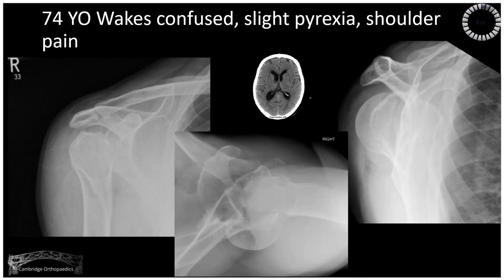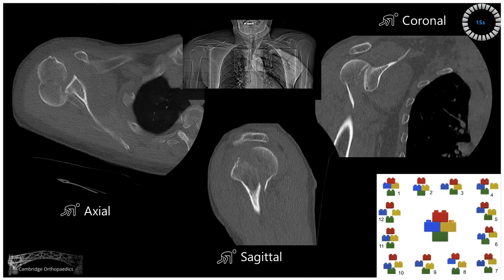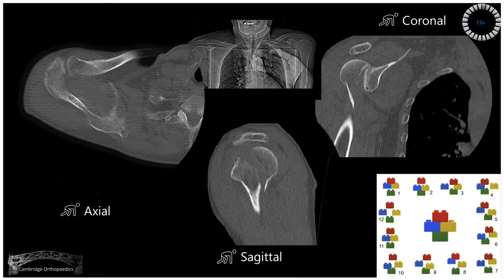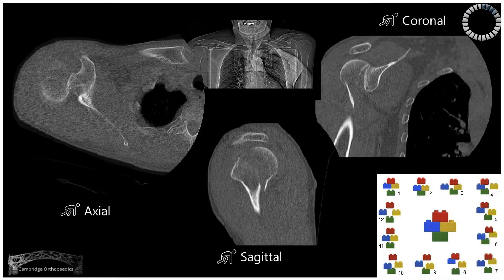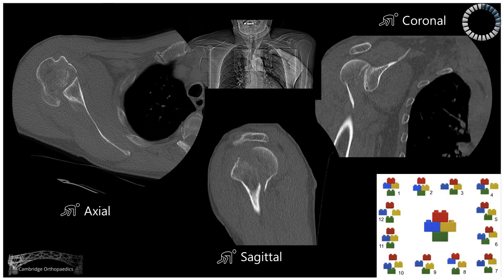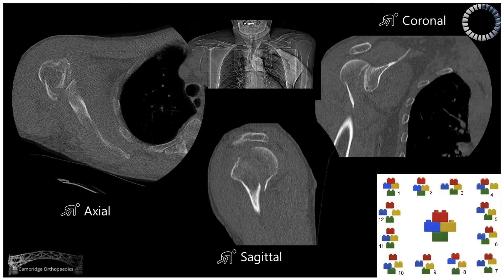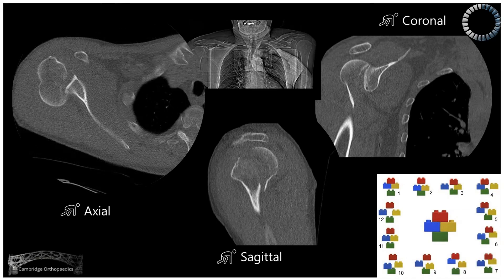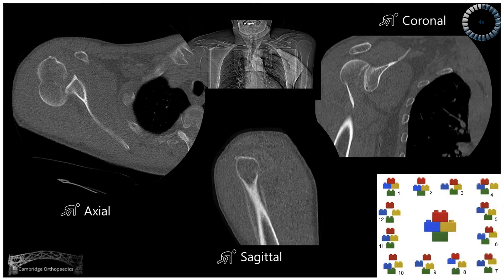Our next patient is a 74-year-old who wakes confused, slightly pyrexial, and presents with shoulder pain. Here are the axial, sagittal, and coronal CT scans. Characterize the fracture or classify according to Neer and consider Hertel's Legobrick classification.